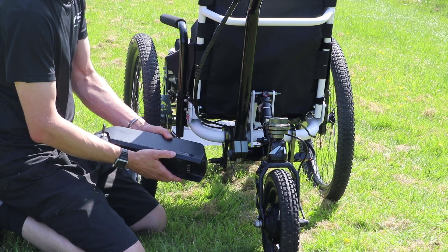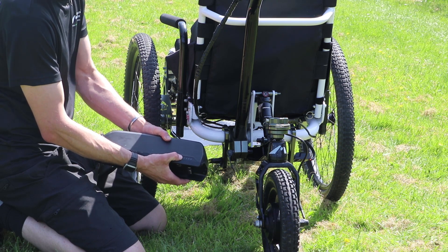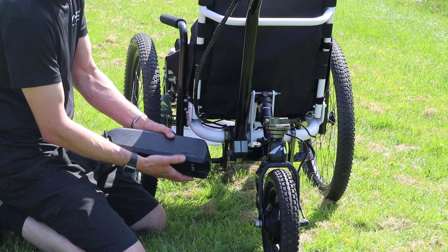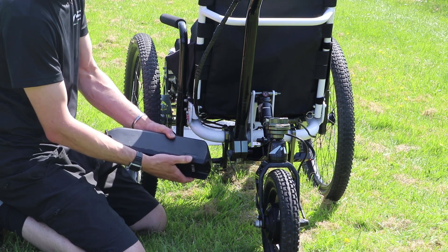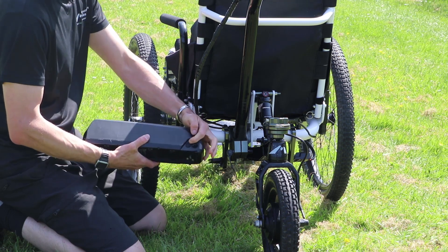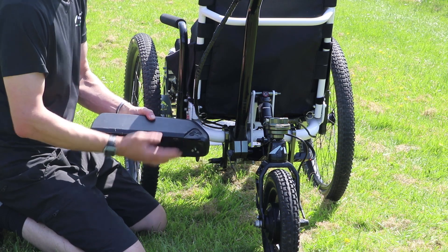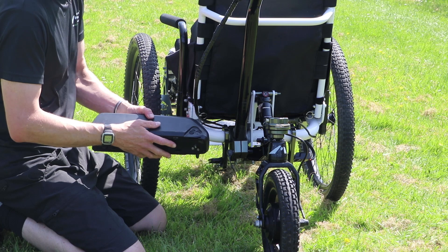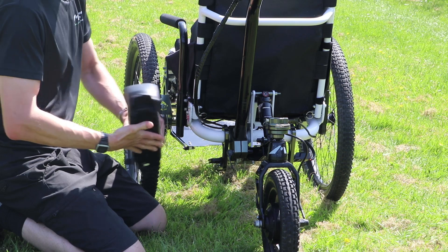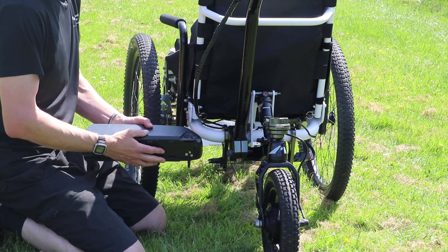Before refitting the battery, make sure that the battery is switched off. You have the on/off button here. To turn the battery on, press and hold and you'll see the green lights. To turn it off, press and hold again and all the lights go off. The battery also has the charging port on the other side. When you want to charge the battery, you can take it into your house, plug it in, fully charge it and then slot it back into position. It can be charged in position on the trike, but most people find it easier to take it off.